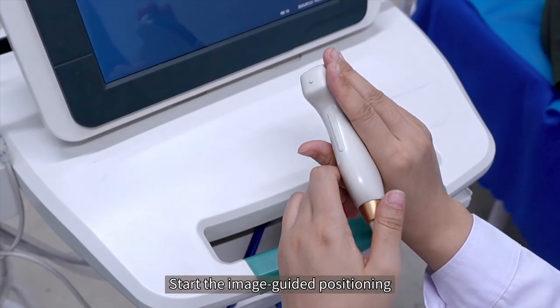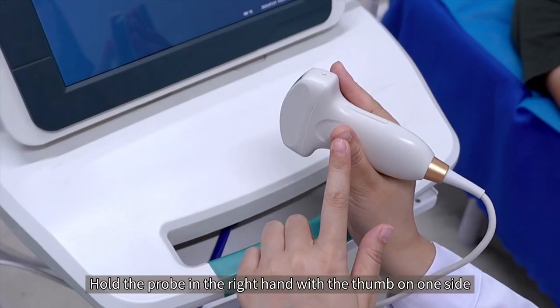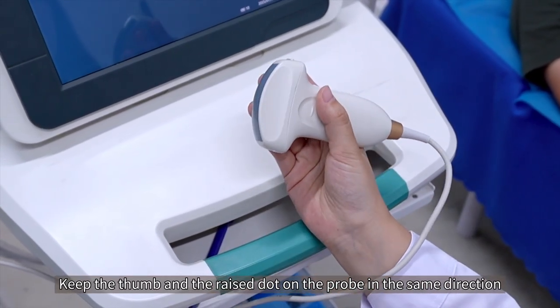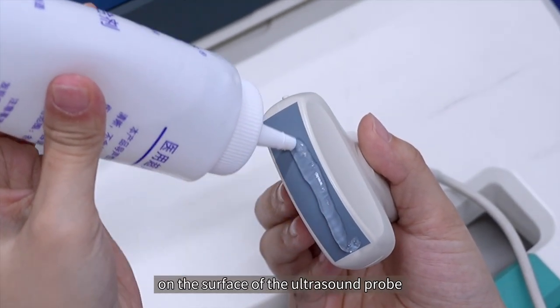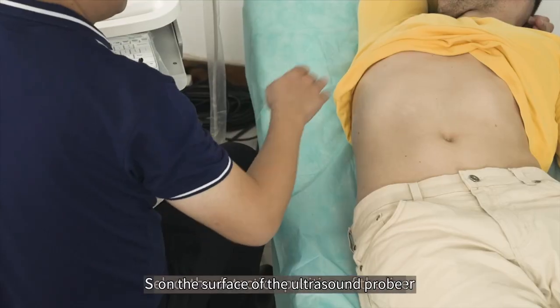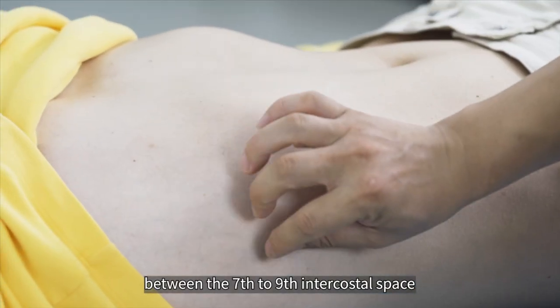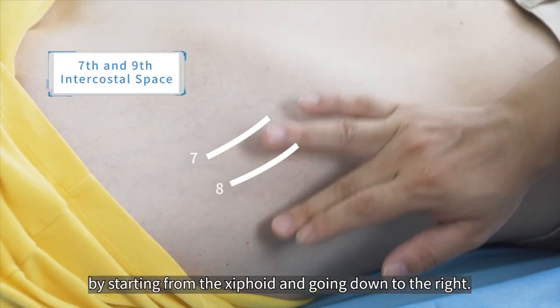Start the image-guided positioning. Hold the probe in the right hand with the thumb on one side. Keep the thumb and the raised dot on the probe in the same direction. Apply an appropriate amount of coupling gel on the surface of the ultrasound probe. Select the detection position of the liver between the 7th to the 9th intercostal space by starting from the xiphoid and going down to the right.